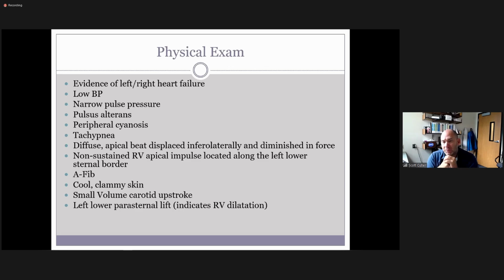That's sort of done off of pattern recognition, looking at the actual tissue. It's going off of a database of thousands of real cases that have been measured, comparing those to what the system sees on your image, and then making the best extrapolation of that. Then you can adjust it, and that's how your auto EF works. Every vendor is a little bit different. That's how Siemens does it. Other vendors do it off of just recognizing border detection. Similar ideas, just a little different way of attacking it.